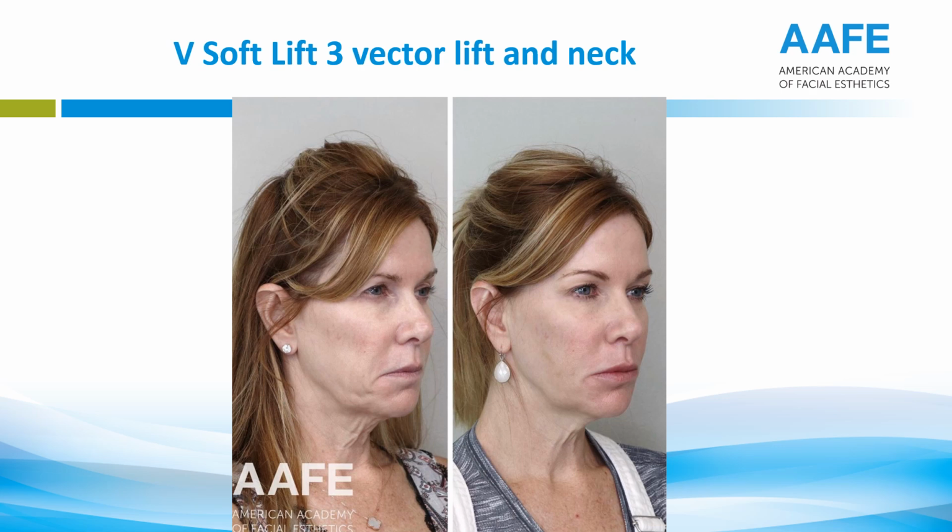All right, here she is right after this. Hang on one second, let me get this to work correctly. Here she is right afterwards. Well, not right afterwards. Here she is healed up from the lifting PDO threads.